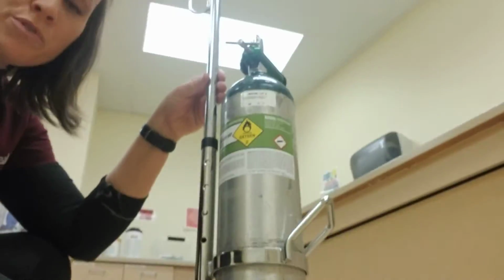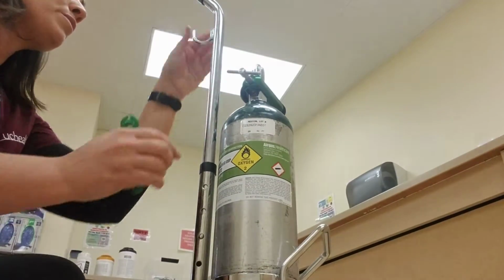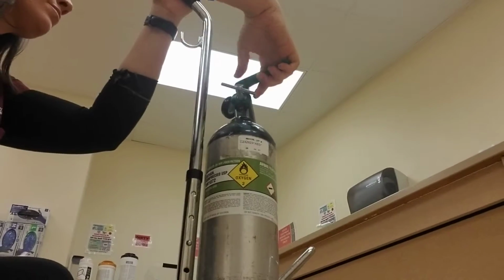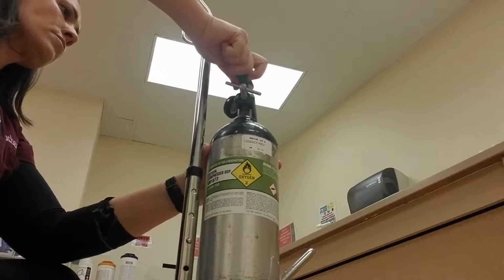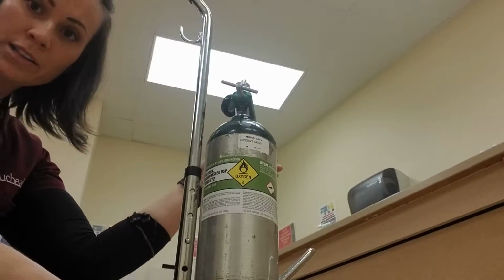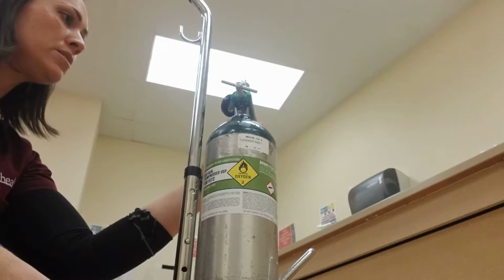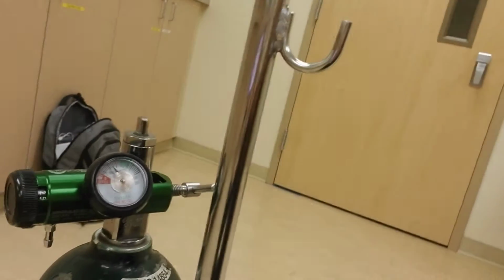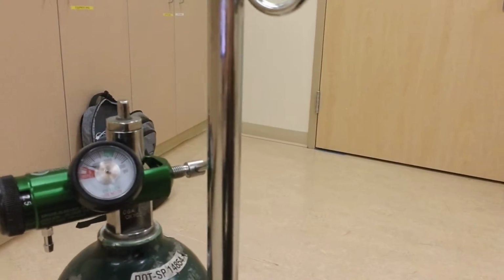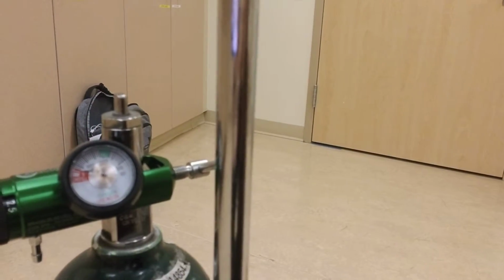I'll show you how to remove this regulator. So we want to make sure that we shut the gas off. Okay, nice and tight. And then we'll go ahead and let it bleed out, which will flow back on. And we can see that the pressure is now going down. You'll hear no noise when it's all done, and also the pressure will read 0. Great. Okay, now we know that that's off. Now we can safely take off this regulator.